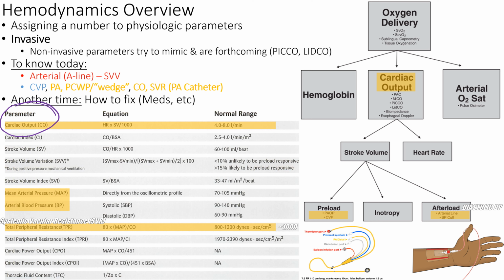I can't tell. All right, by the way, these guys are going to be inserted, and you can get your cardiac output from it, okay? So your cardiac output is measurable by your PA caths, and you can also measure it with your A-line. If we have a fancy device like the Vigileo monitor or a continuous cardiac output monitor, they can adapt an A-line signal and get you a cardiac output, right?